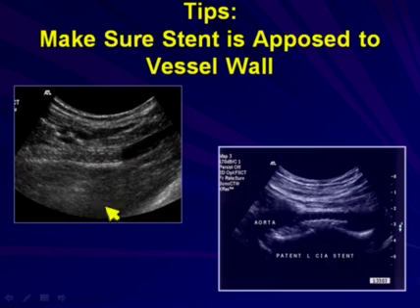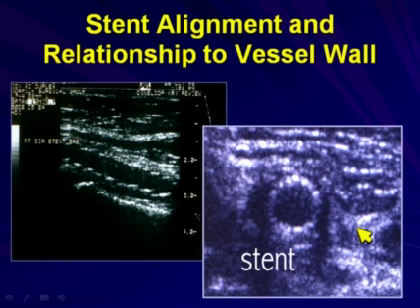If you rotate your hand back and forth, you can see where they begin and end, because those endpoints are important. You can see in this stent that there's still a plaque burden. This has crushed the plaque, but not all the way to the wall of the artery, so that leaves the end of this stent kind of hanging loose here and not quite all the way opposed to the wall, and that's something I'd want to note and keep track of as we follow that patient.